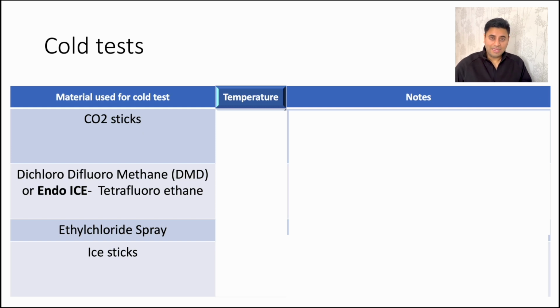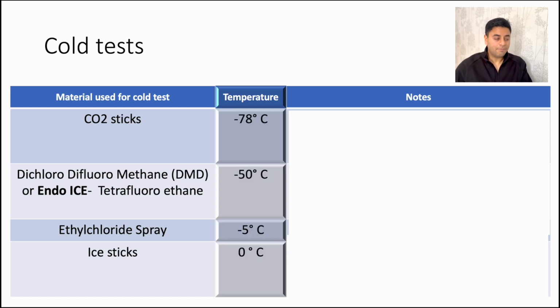So a very common question that is asked in these exams all the time is, what is the temperature of a certain type of cold test? They want to know how much you know about cold tests, how much you have explored the different options available, and whether you know the limitations of those cold tests. So let's look at the temperatures first.